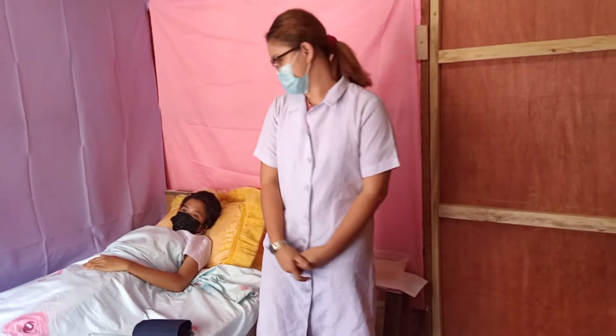So the first procedure for the blood pressure taking is identify and explain procedure to client. Rationale: to ensure right procedure is done to the client and gain the client's cooperation.